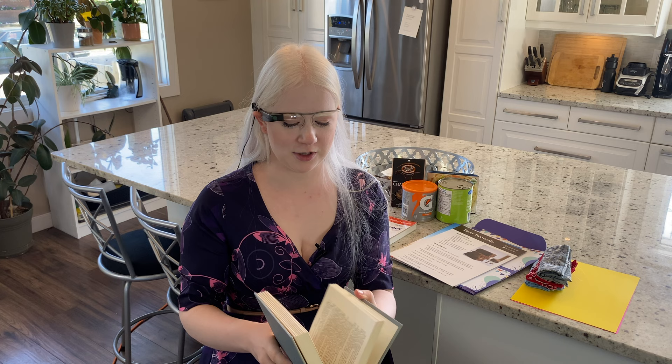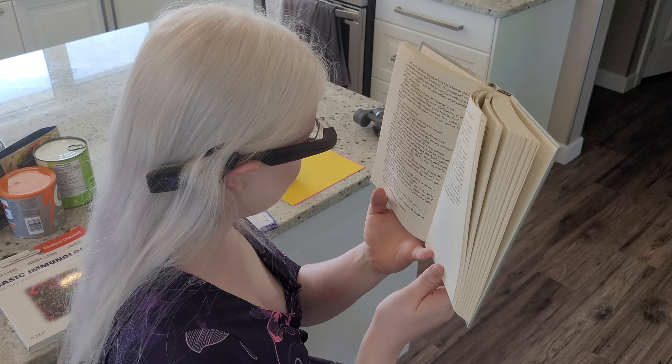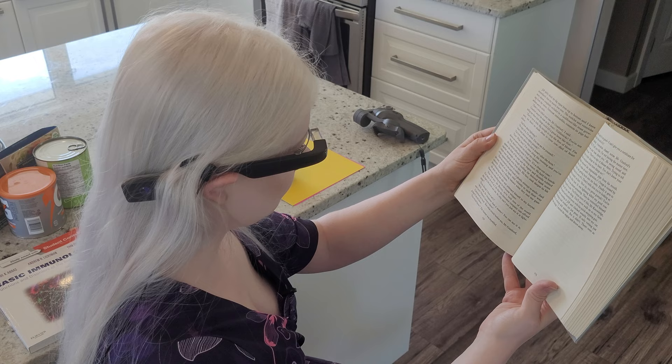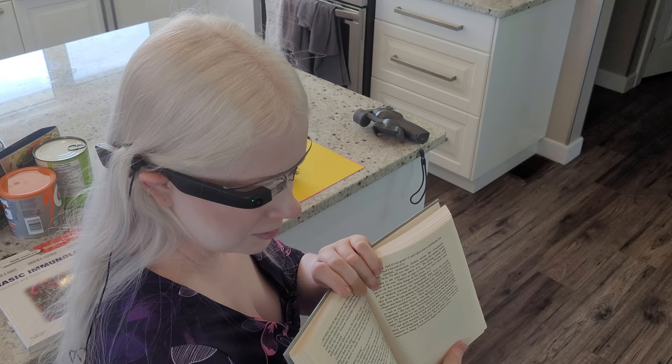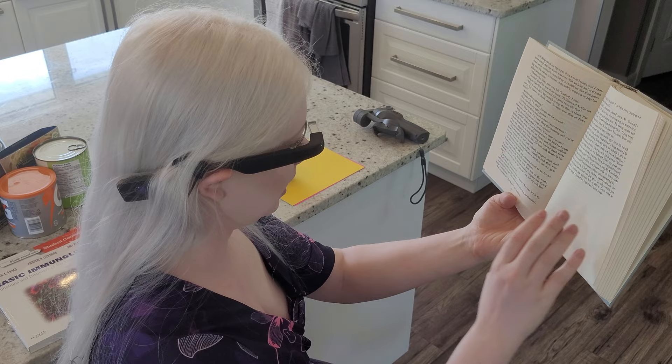Let's grab some other text item here and see how it does with something that it hasn't been trained on. I have a book — I'm just going to flip to a random page. If you hear longer pauses in this video, it usually means I was trying to reorient the document, moving it up, down, towards or away from the camera's field of view to get it to read. The output is mostly garbled and nonsensical. This is not making any kind of sense.